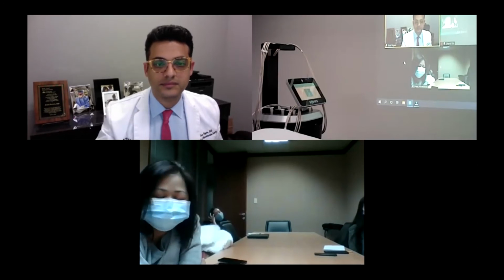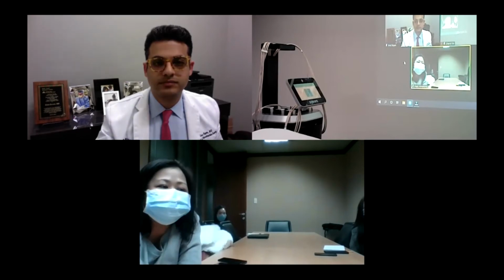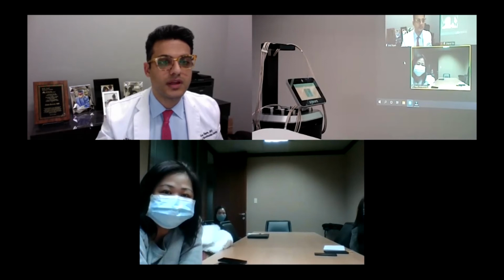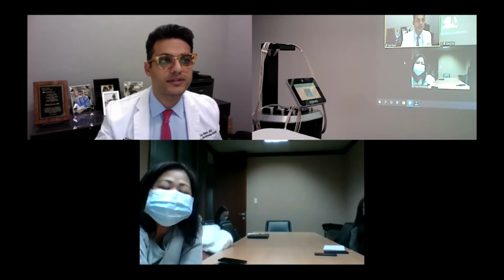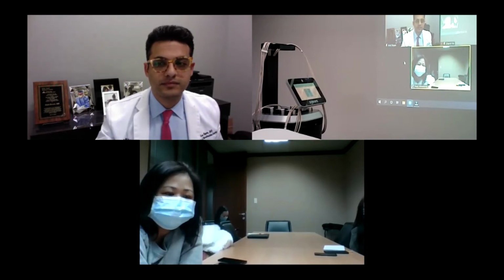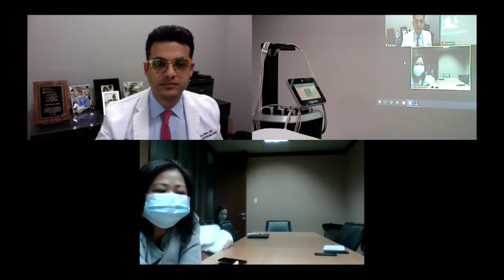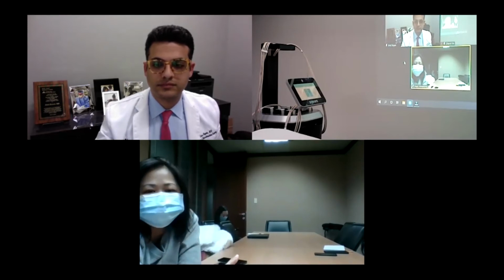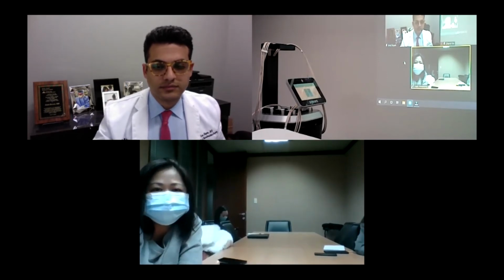I just have one more question, because you mentioned a while ago that your suggested treatment protocol is every 2 weeks, about 5 treatments. Am I correct? Yeah, that's how we're doing it. So we're doing it every 2 weeks, 4 to 5 treatments. Based on your experience in your clinic, if somebody who has higher than 30 BMI, a woman probably, if she's undergone the 5 sessions, what can she hope to achieve? Like, what's the maximum and what's the least based from your practice?